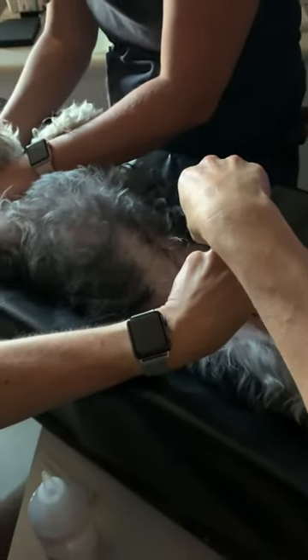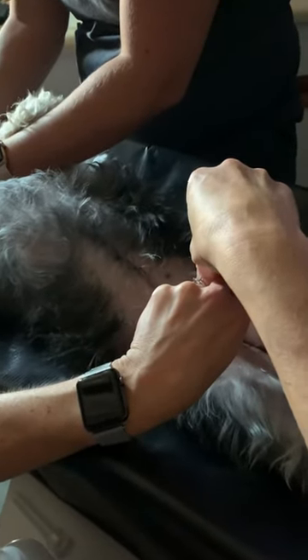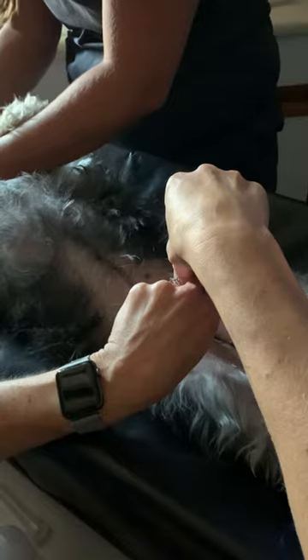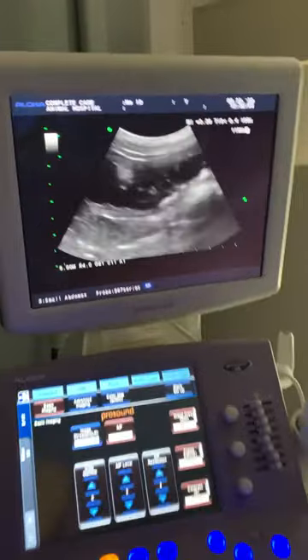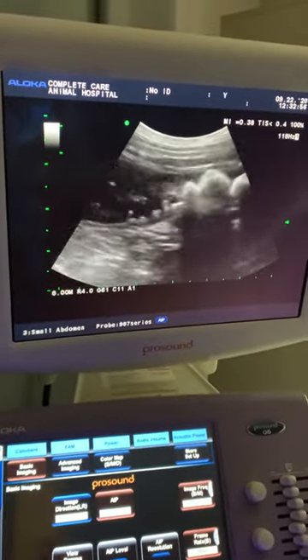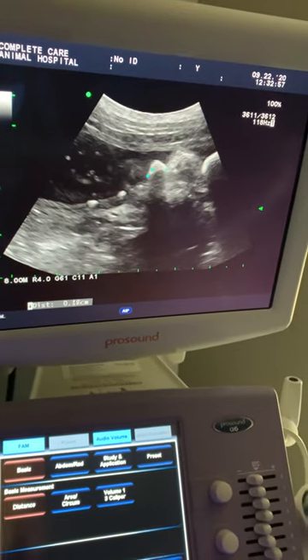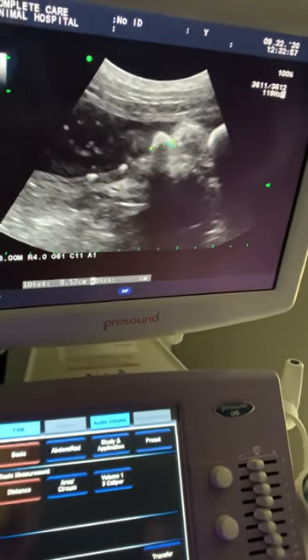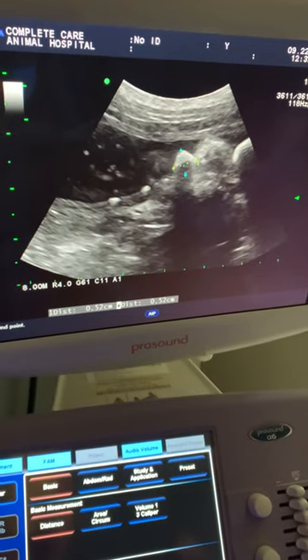We're going to stick a needle right into the bladder. There's our urine — that's the way we have it sterile. The other question we get a lot is: can't you just bring us a sample? The answer is no, because we can't culture a sample that way — especially in these cases, we need a proper culture. You can tell that was not uncomfortable for her. We can see these stones and also take measurements of them. We will recheck this dog in a couple of weeks and make sure that these have resolved.